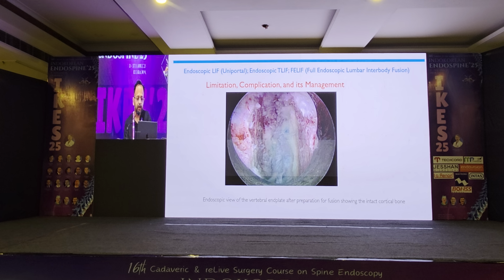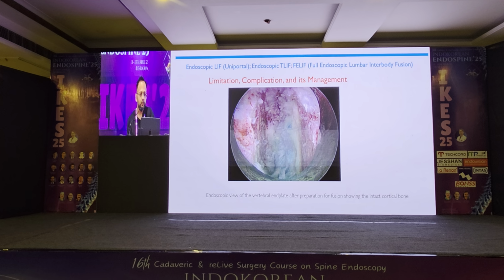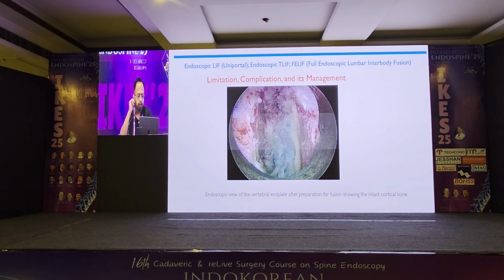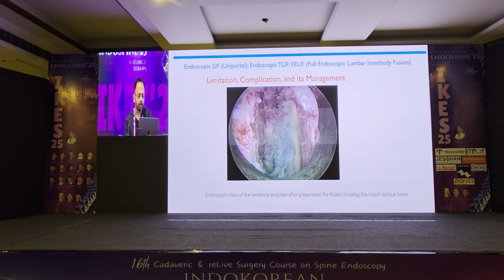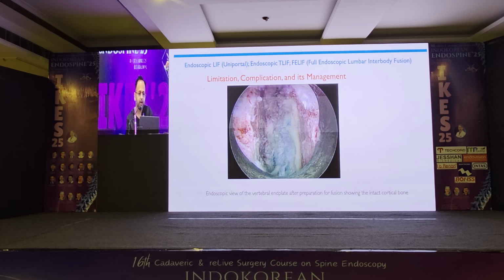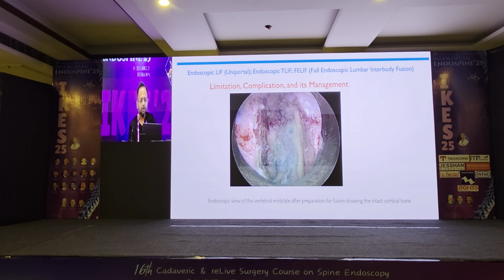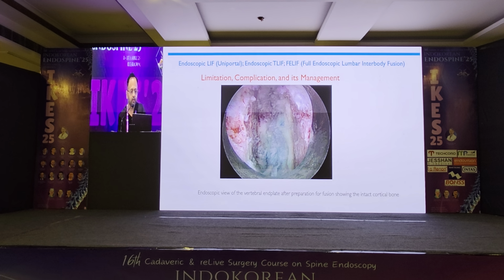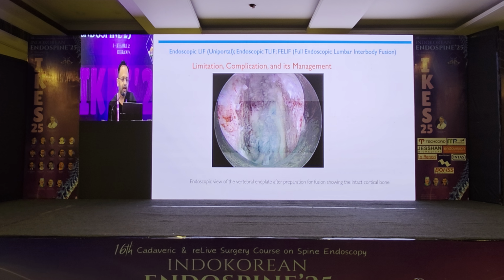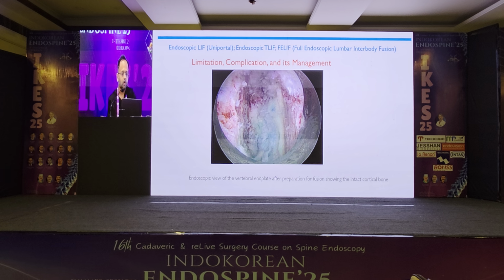Compared to MIS TLIF, the success of endo TLIF is good because of two reasons. One is good endoscopic end plate preparation. Next, there is a good study done by Dr. Osman, who started doing transforaminal fusion. They found that if the end plates are covered by 30%, that is enough for fusion. It doesn't mean you need to have a 100% fusion bed. The Western world has cheated us, saying that putting an XLIF or an OLIF is good because it has a 100% fusion bed. I feel it is not much required.